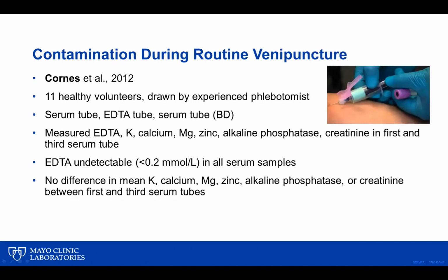So these studies are the ones that were cited in the European Federation Working Group document. This was one study of 11 healthy volunteers drawn by an experienced phlebotomist. In this experiment, they drew a serum tube, a potassium EDTA tube, and then a second serum tube to try to measure in a healthy outpatient if there was any measurable EDTA carried over from the middle tube into the second serum tube. And the answer is actually no.